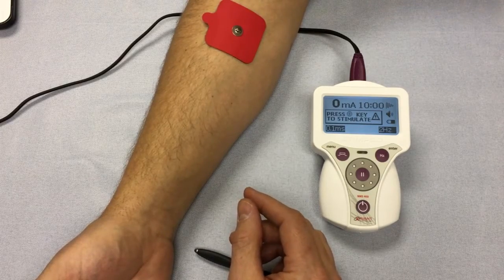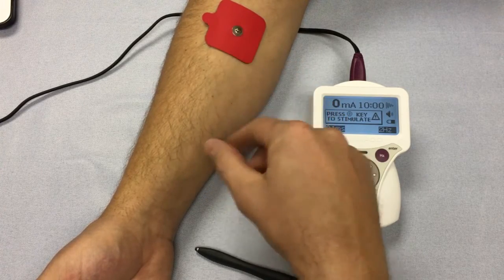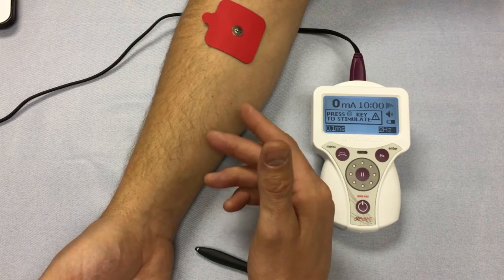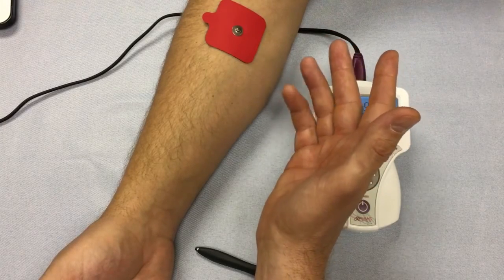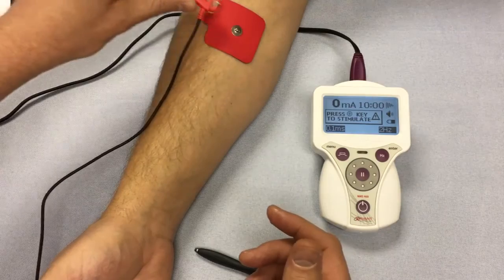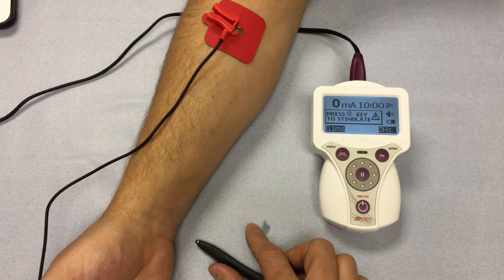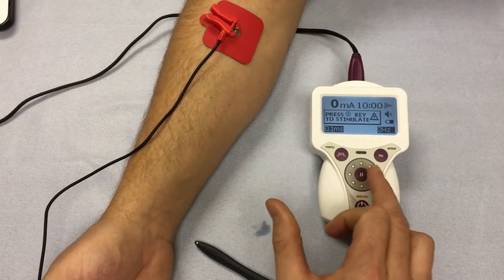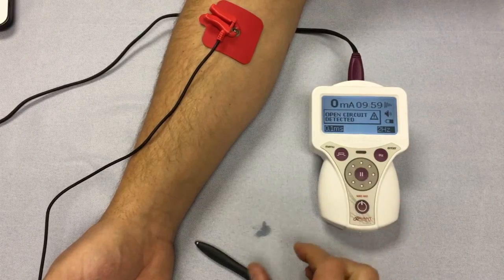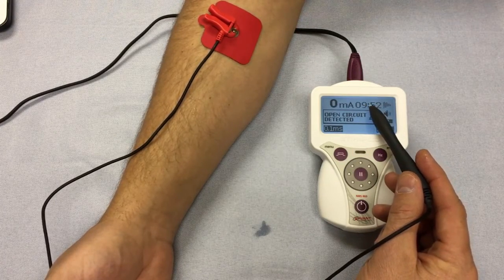The next step is to connect the reference electrode. It's important for the reference electrode to be some distance away from the treatment area to ensure the current does not stay on the surface, allowing it to penetrate deeper. We would normally recommend placing it contralaterally; for this video we've extended it as far from the treatment area as possible. Take the red electrode clip and clip it onto the reference electrode. We are now ready to start treatment — press the center button with the pause symbol. The countdown timer will start counting down from the default 10 minutes.